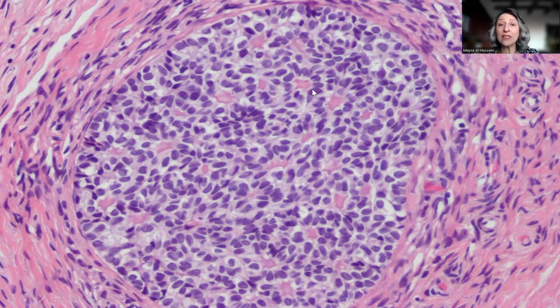So we have stromal cells surrounding lumina containing acidophilic secretion, but we did not see any of the dysgerminoma cells within the formation. And my explanation for this was that because of the response to the chemotherapy in the dysgerminoma component of the tumor, the same cells disappeared from the gonadoblastoma component.